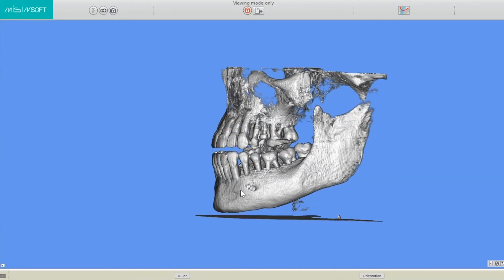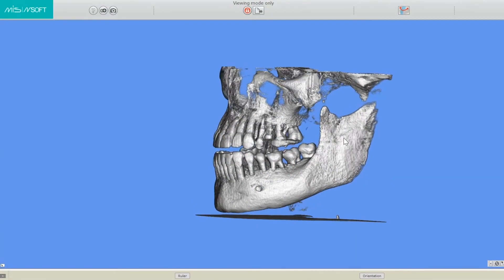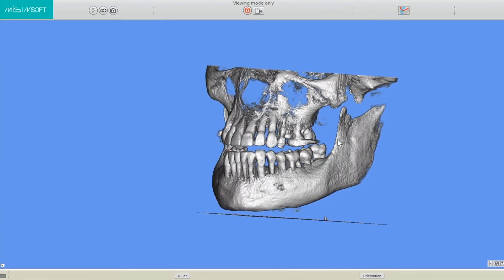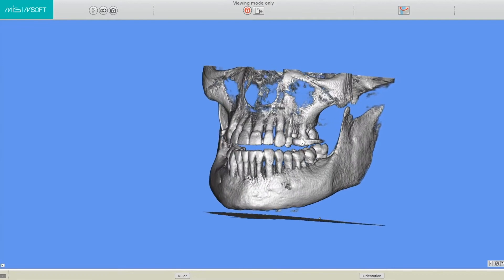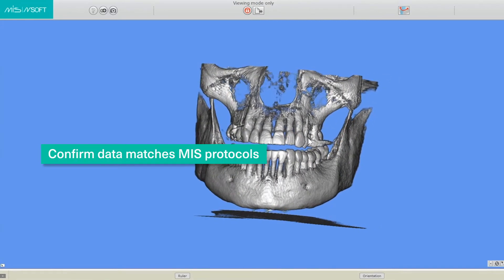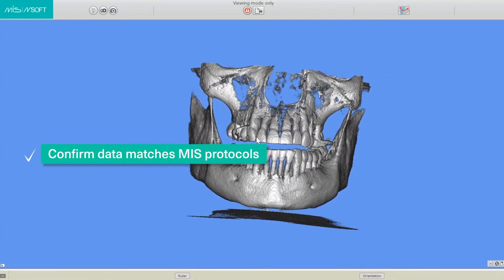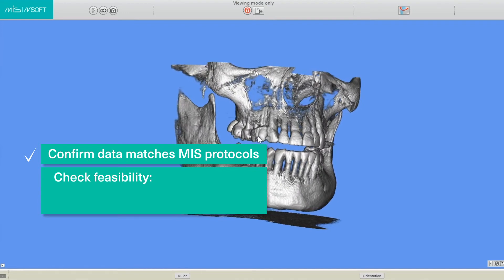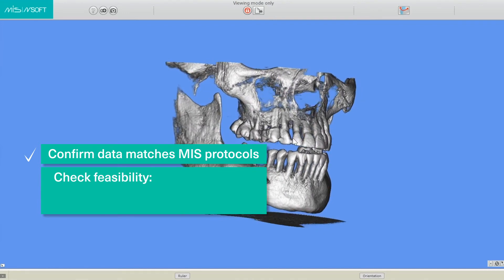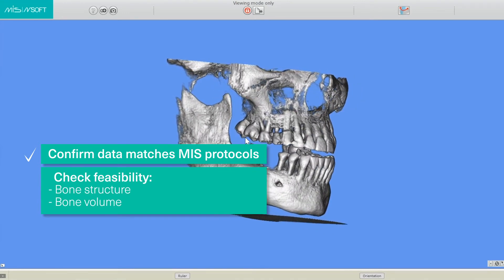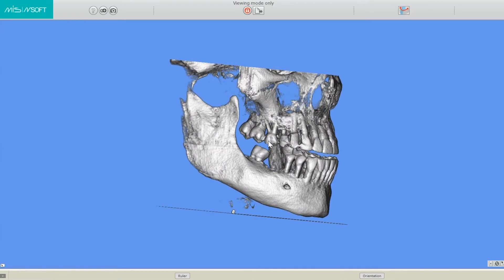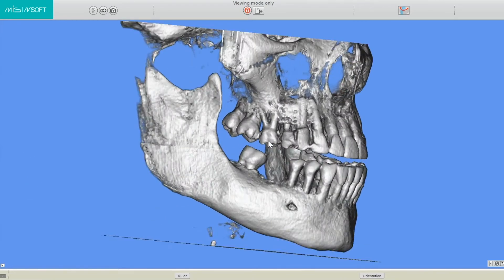In this video, we will learn how to upload a DICOM into the MSOFT software, confirm that the data is according to the protocol and may be used, and check the feasibility for implant placement in terms of bone structure and volume. Our example would be a single implant to be placed in the lower jaw.